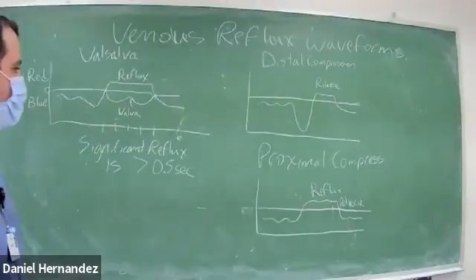So with proximal compression and Valsalva, they're similar or going to look similar. Yep, yeah. Cool.